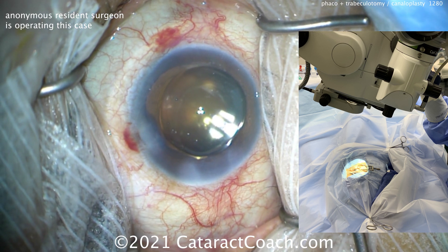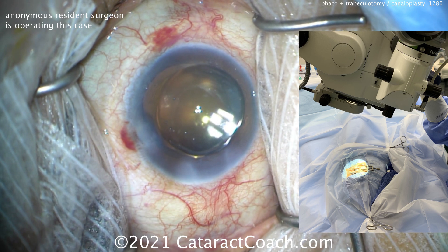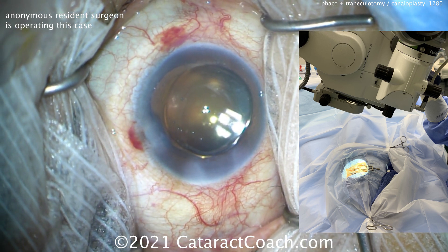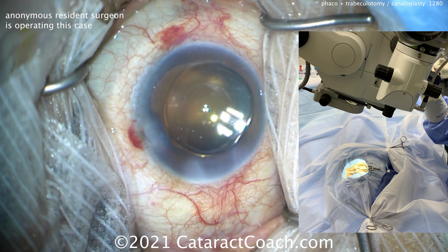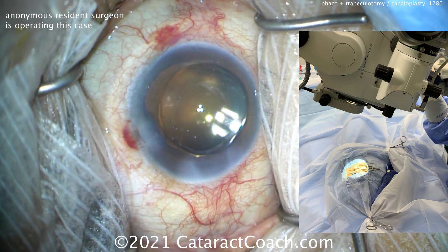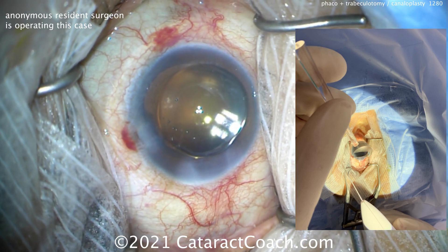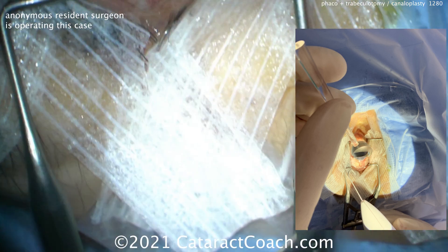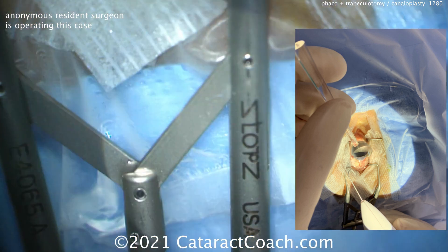So here's the microscope. You can see the tilt there — the patient's head is tilted away from you and the microscope is tilted towards you, and that's going to make your life a lot easier with a much better view for you. So let me show you that position: there's the gonio prism going down in the left hand, and then the right hand is going to hold the Omni device, the MIGS device.